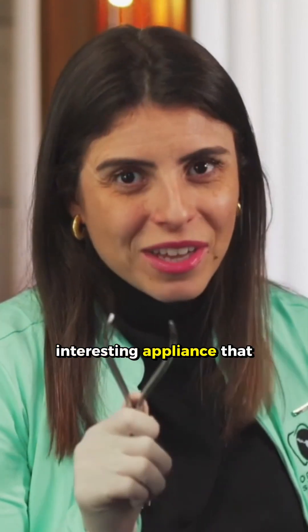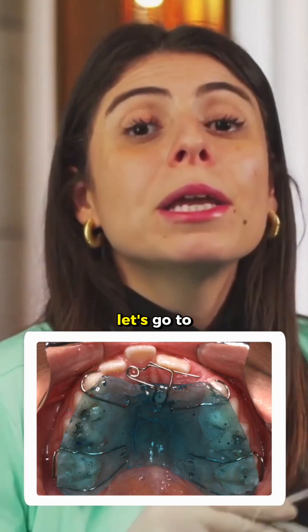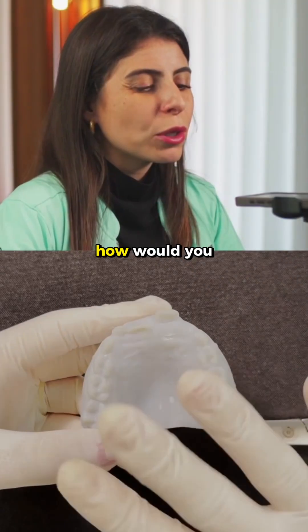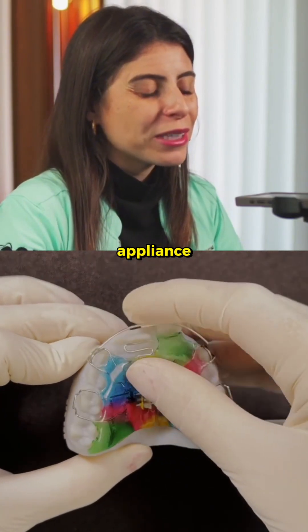Today we are going to start with a very interesting appliance that is used to uncross incisors, both central and lateral. Let's go to our number one device, the S-Spring. How would you uncross an incisor very easily and quickly? Well, it would be with the S-Spring appliance.